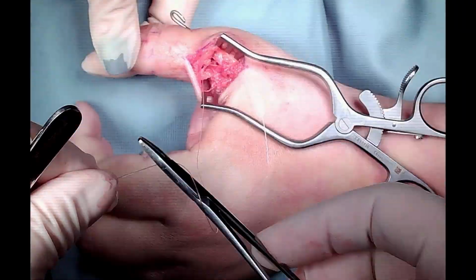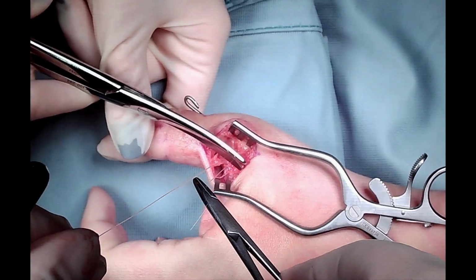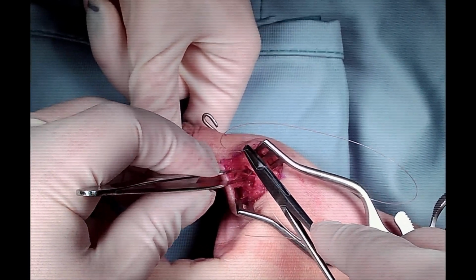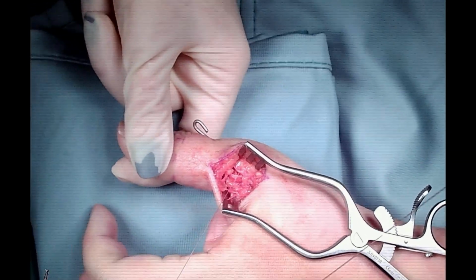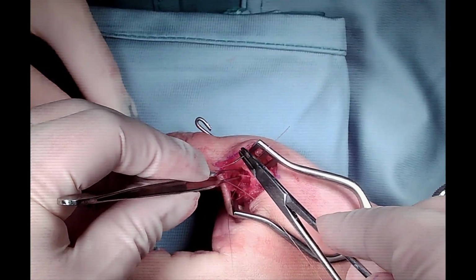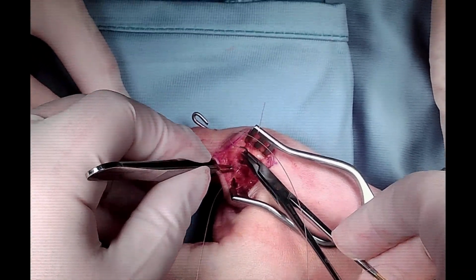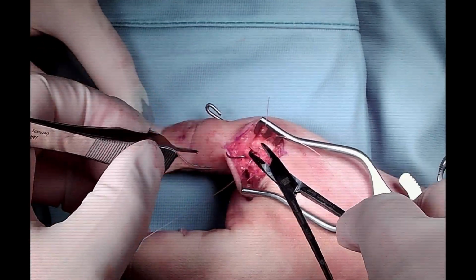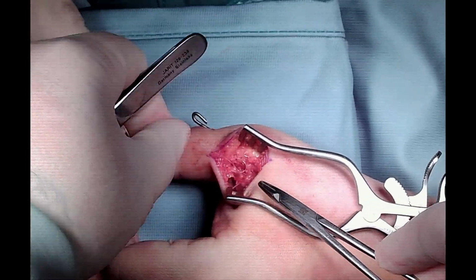As we can see here, this is not a Stener lesion. Stener lesions leave the collateral ligament out of the adductor. In this case, we needed to open the adductor fully in order to expose and delineate the injury of the collateral ligament. So we meticulously close the adductor with the extensor mechanism in order to restore full function of the thumb later.